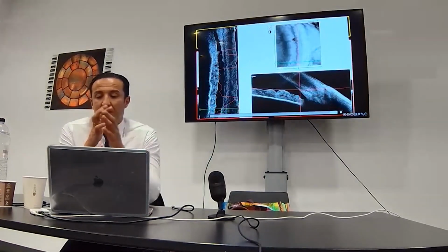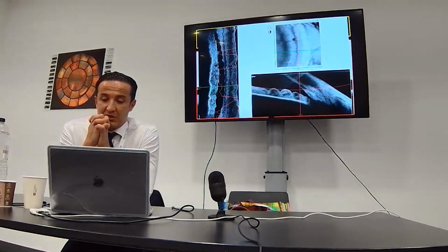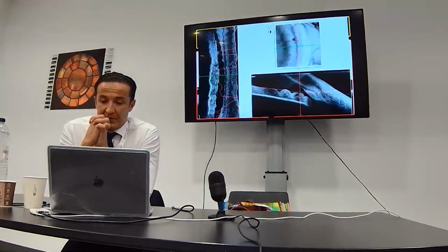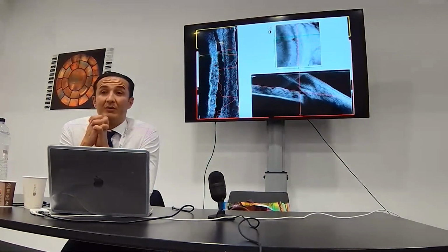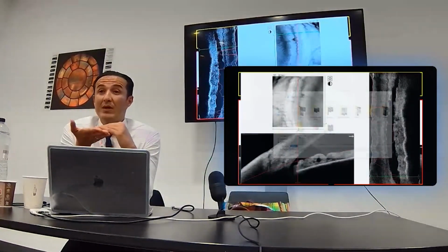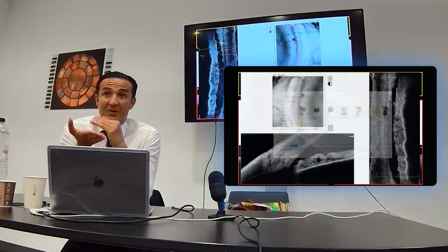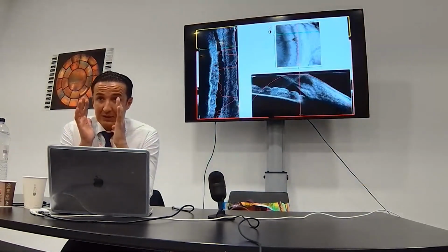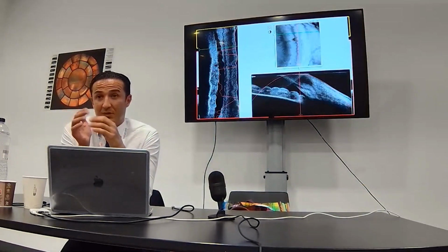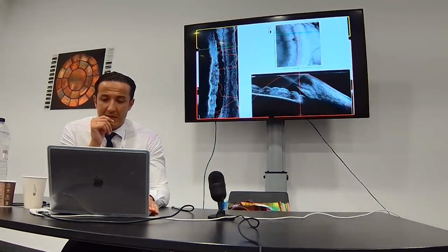And look here, in 5 seconds you can obtain this cube, and you can check the iridotomy to avoid the eye motion of the patient. Because when you use just one B-scan, you are disturbed by the eye motion of the patient. If you use the cube approach, it's really easy to check your iridotomy.